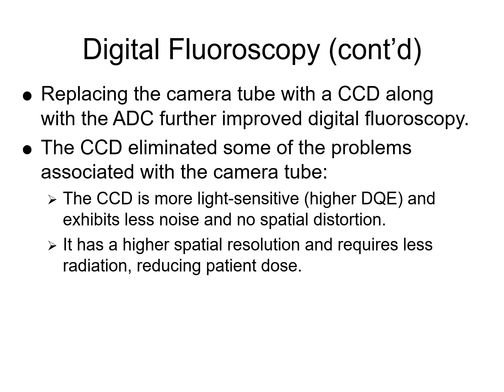And so you get stretching and distortion at the edges of the old video camera, the old television camera. But because the CCD is a flat technology, we've engineered that distortion away because we don't have any curved surfaces on the CCD. As far as the light capturing surface, it is completely flat. That wasn't the case with the Vidicon or the Plumicon. So we don't get the stretching of the image at the corners like you would with an old style television camera. Okay? It has a higher spatial resolution because of the way it subdivides the image into very tiny images.